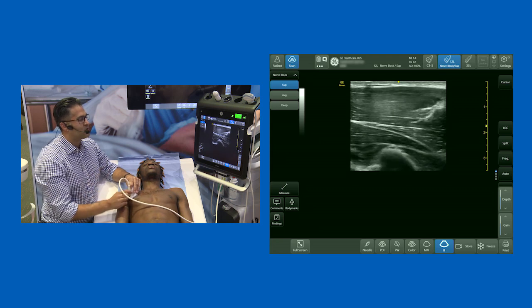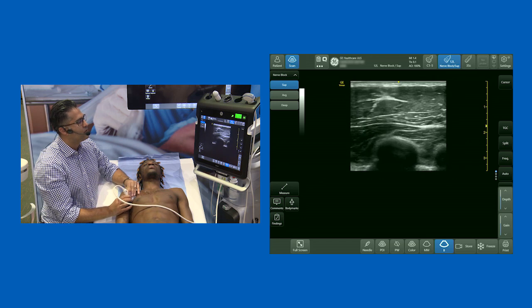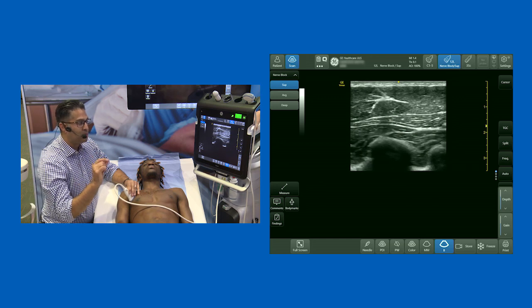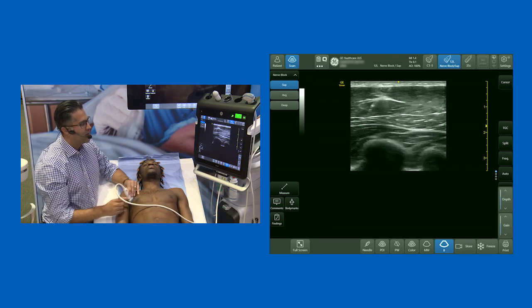When the PEC 2 block was described, and the serratus plane block was described, there were some variations about whether you should inject above or below serratus. The truth is you should inject wherever you get a nice plane that you can open up, and probably the key to the success of that block is to hydro-dissect your path along that fascial plane.